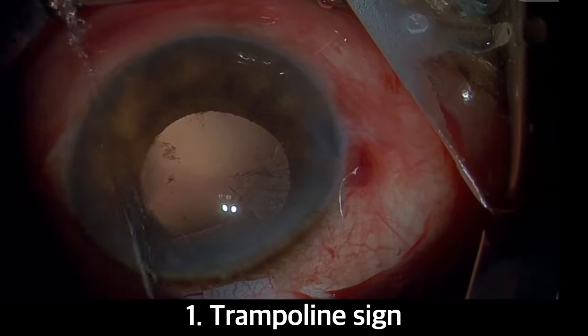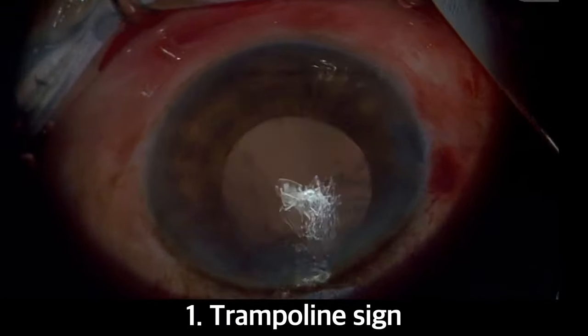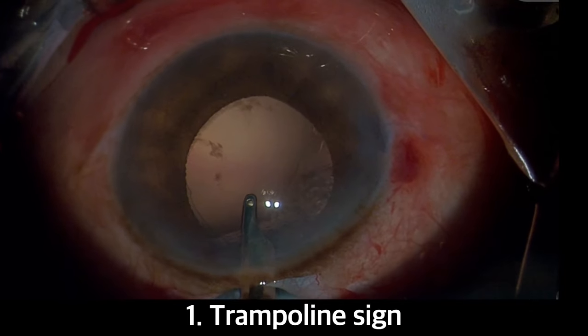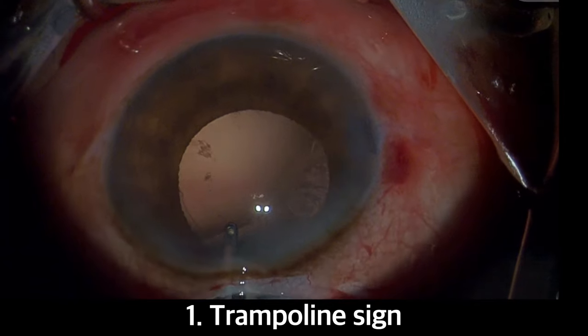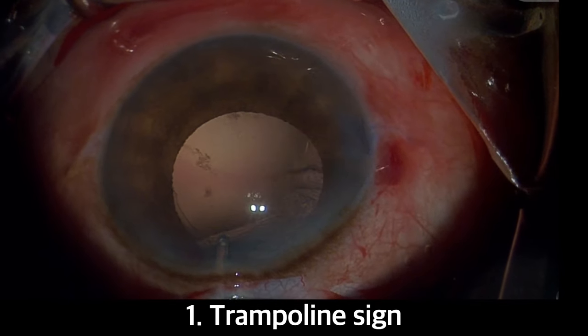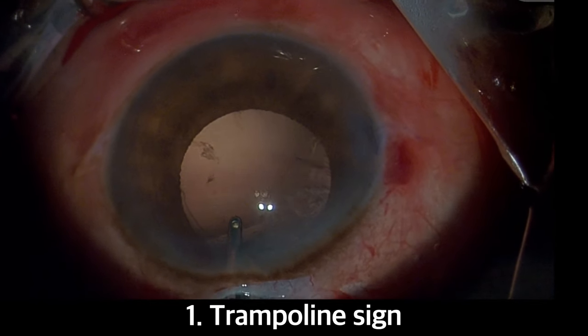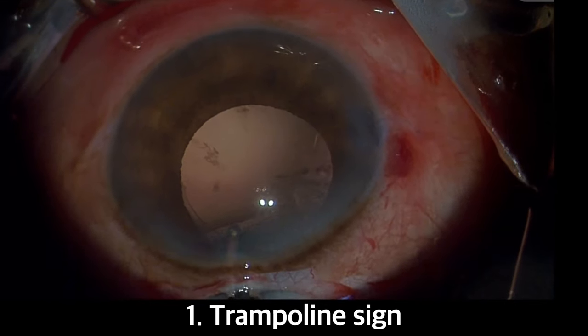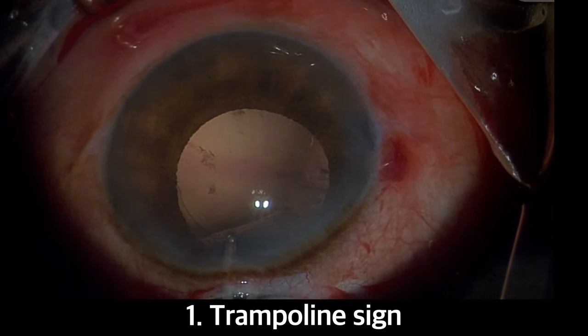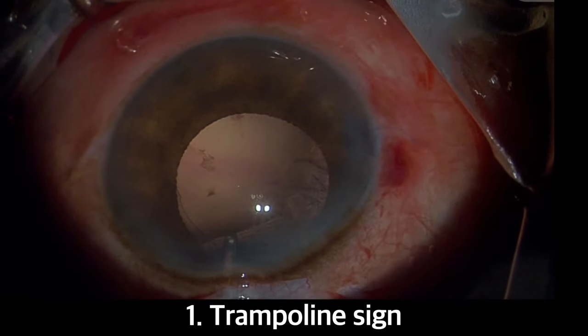First up, the trampoline sign. This is a simple and safe sign for young residents during their surgical training. When you place an irrigating Simcoe cannula at the incision area and gently move it up and down, watch the posterior capsule moving anteriorly and falling down posteriorly, just like a trampoline. This sign can be demonstrated either through the main incision or through the sideport incision.